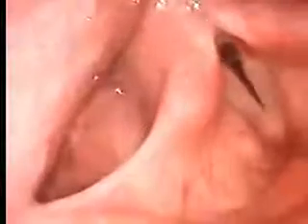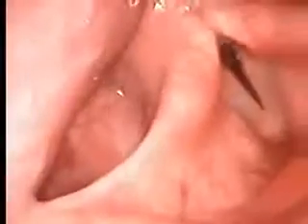Rotate the head from one side, then to the other. For all portions of this exam, the endoscope is advanced as close to the tissue as possible without touching. Touching the tissue may elicit a prominent gag reflex.